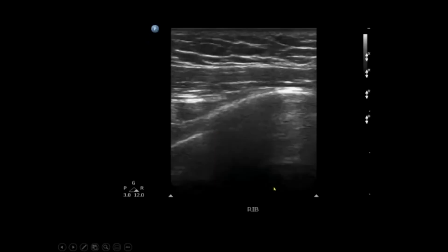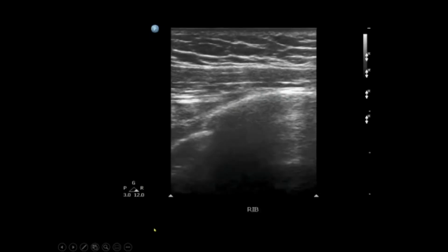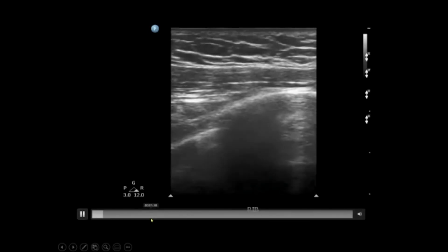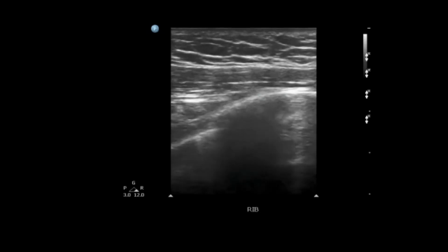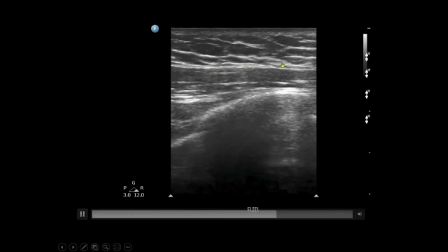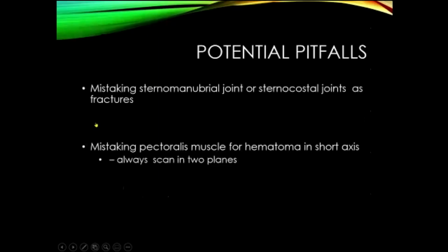the rib itself. So as you're looking, this is the bony part of the rib, and you can actually see the lung sliding underneath. So you want to make sure that you can actually see both of those things, lung sliding and the rib, to make sure that you are not in the wrong place. And you can also think of the fascial plane as a rib. So if you can see the rib and the lung underneath it, you know you're in the right place.